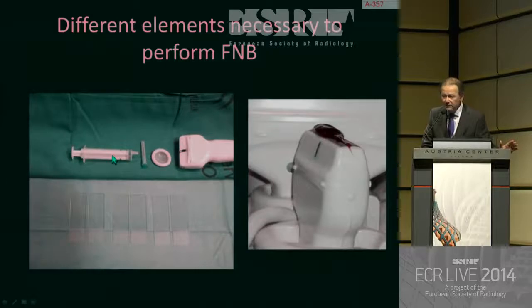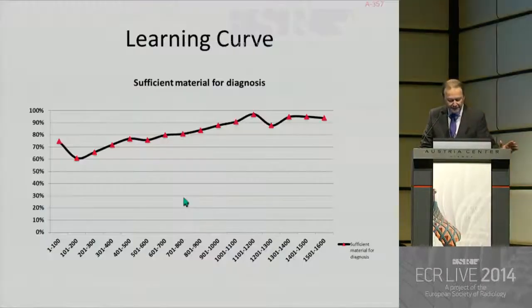And also the syringe. The syringe most of the time is just for holding the needle, because most of the time the puncture is non-aspiration. The thyroid is so vascularized that if you begin with aspiration, you have more probability of getting bloody material. Most of the time I do 3 passes, and then I get 3 samples and 6 smears to send for cytological analysis.